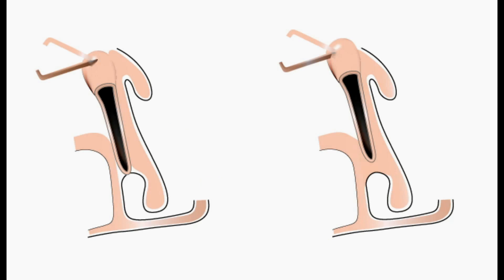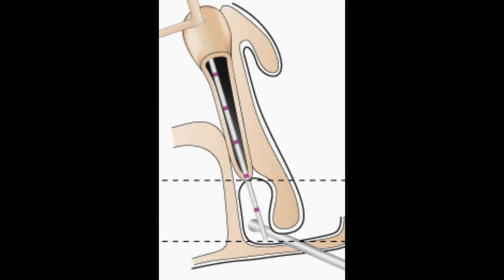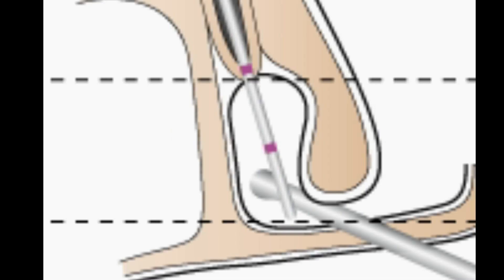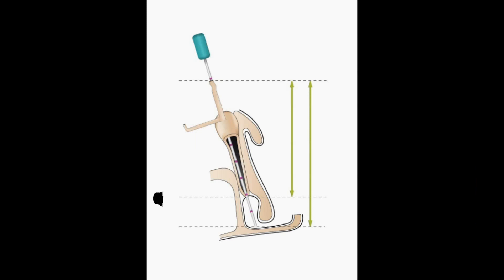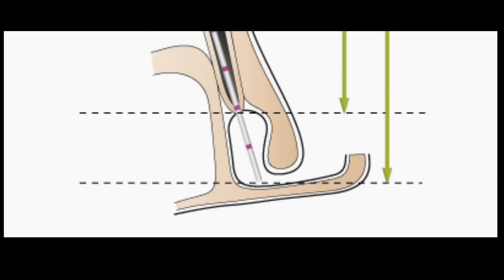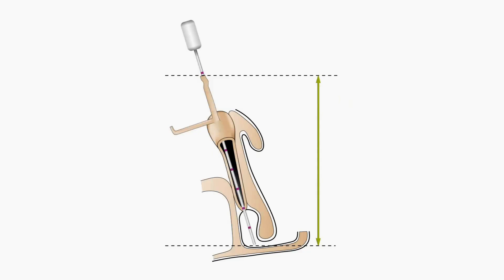Tactile sensations felt during the exploratory probing permit the surgeon to distinguish between simple nasal lacrimal duct stenosis and more complex obstructions, thereby allowing the surgeon to assess whether the Master Ka stent system is appropriate for the specific patient. A larger lacrimal probe with a blunt tip is advanced carefully beneath the inferior turbinate, searching for metal-to-metal contact to confirm proper location. The distance between the punctum and the nasal lacrimal stenosis is measured, as well as the distance between the punctum and the nasal fossa floor. The length of the Master Ka should be about 5 mm longer than the distance between the punctum and the site of obstruction, but should not exceed the distance to the nasal fossa floor.